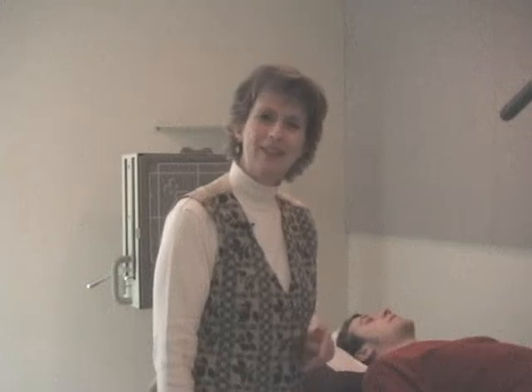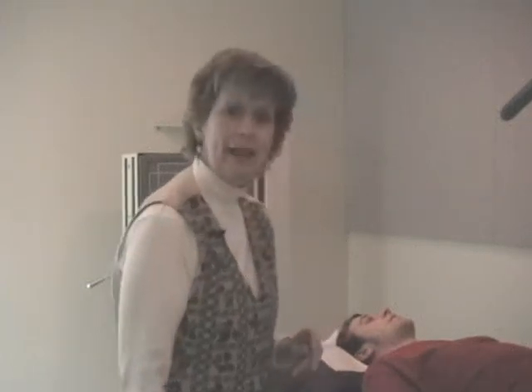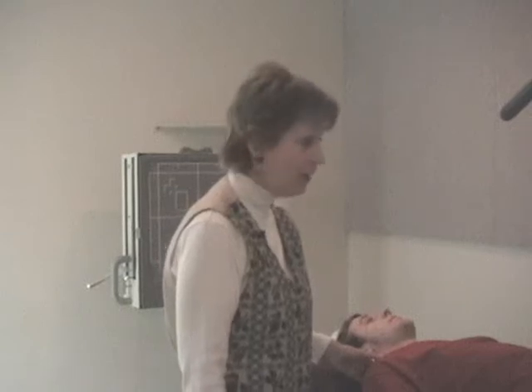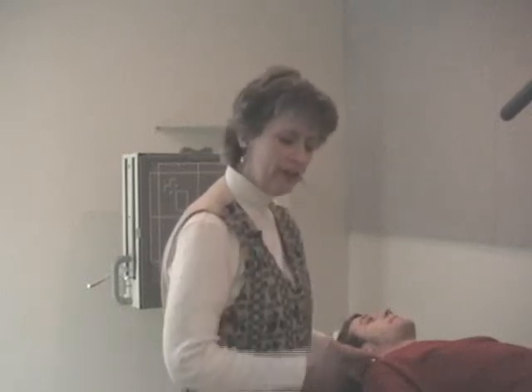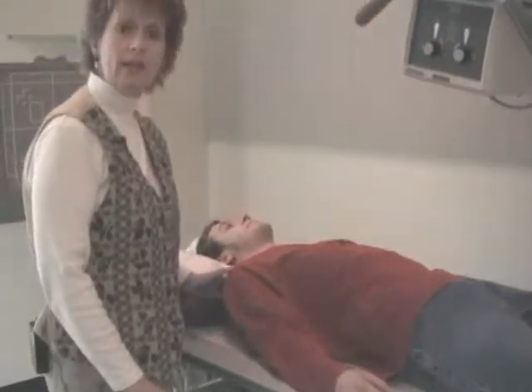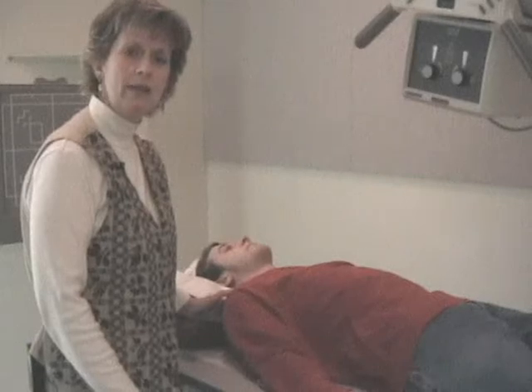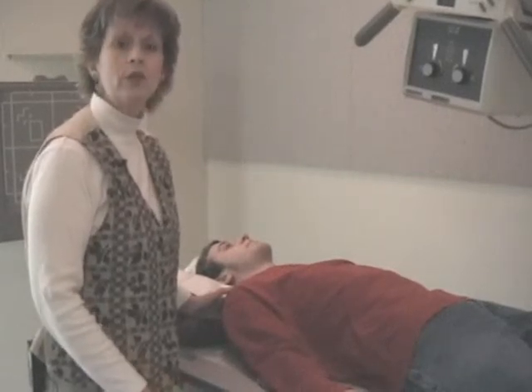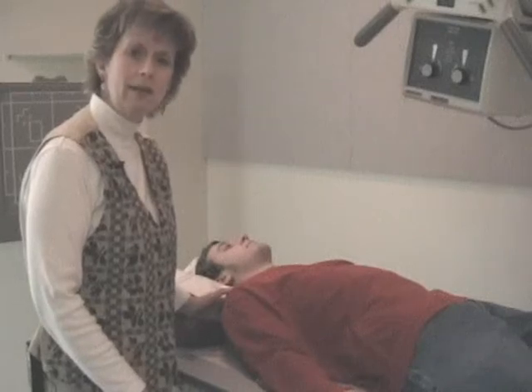Hello again. How are you today? We have Larry on the table, and we're going to do a sacrum coccyx for you. We've got things pretty much preliminary set up, so let's take a look at the patient. For sacrum coccyx, we're going to do an AP sacrum, an AP coccyx, and then a lateral, which will hopefully demonstrate both the sacrum and the coccyx.